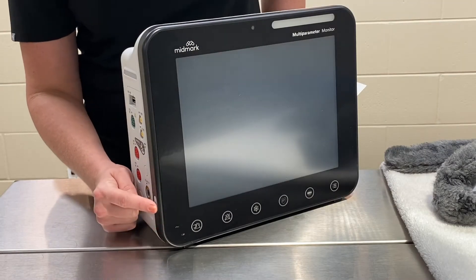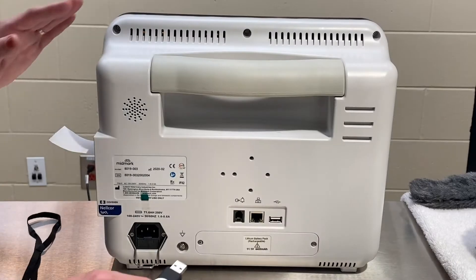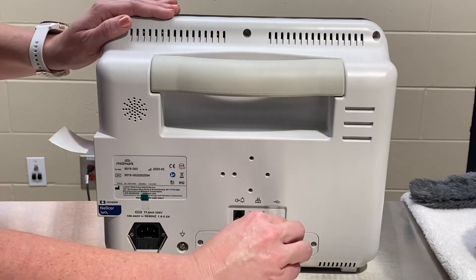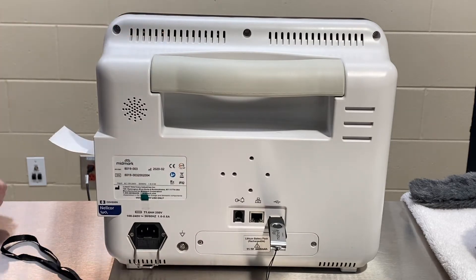Power on the monitor by pushing in the power button on the left side of the machine. Plug in the Midmark Visualizer USB drive into the USB port.